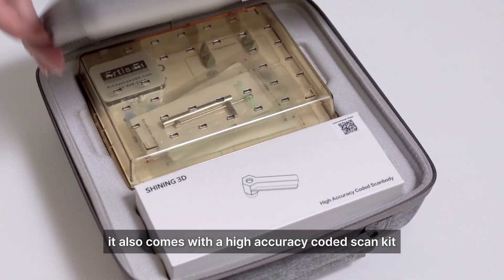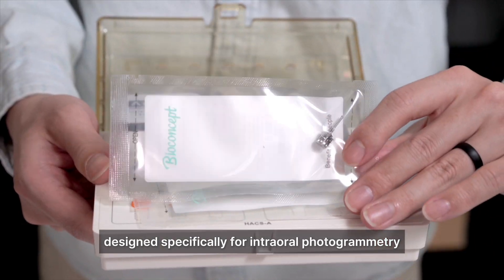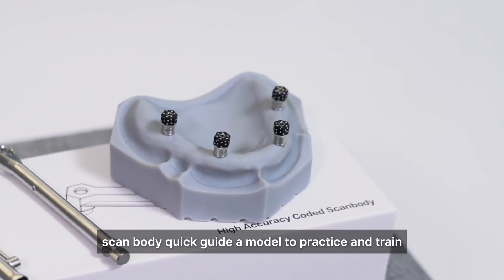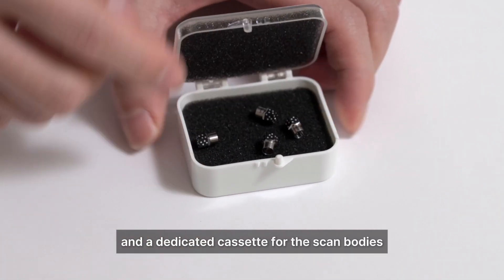It also comes with a high-accuracy coded scan kit designed specifically for intraoral photogrammetry. That includes multiple custom scan bodies in various sizes, a scan body quick guide, a model to practice and train on, screwdrivers and torque wrench, and a dedicated cassette for the scan bodies.